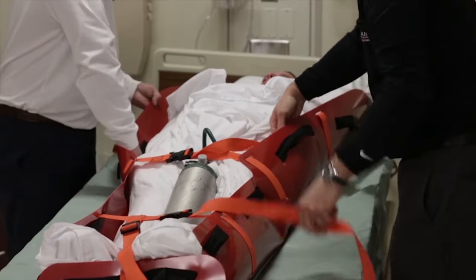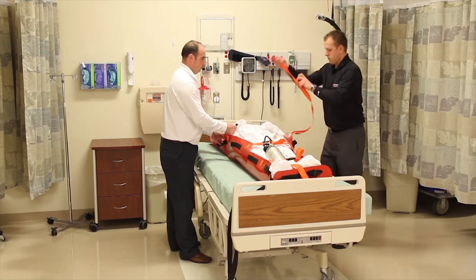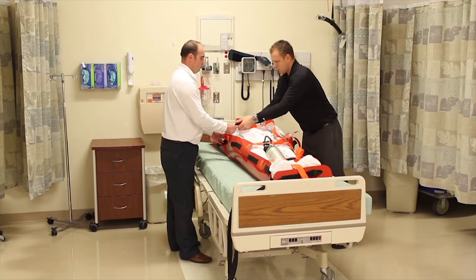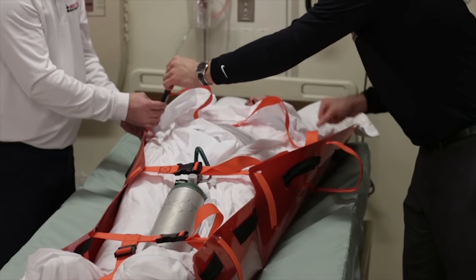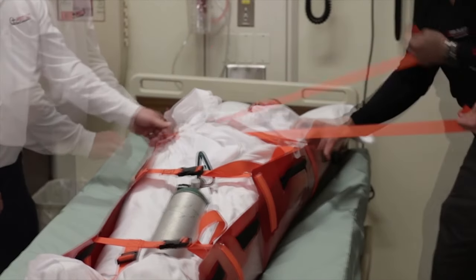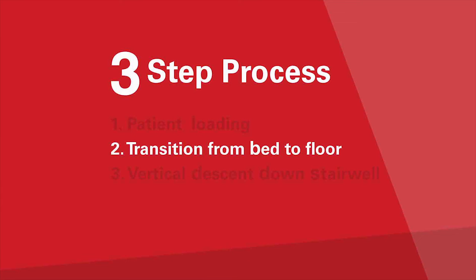Repeat this process for the remaining cross straps. However, before tightening the top strap, position the patient's hands along their side and fold it at the belt buckle. Do not use straps near the throat or head. If the top strap is too close to the patient's neck, you can simply crisscross the top and middle straps. Finally, secure all strap ends inside of the sled. The patient is now ready to be lowered to the floor.